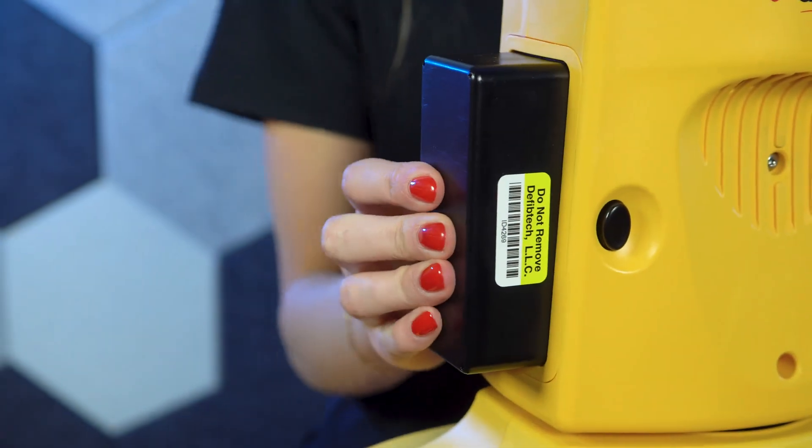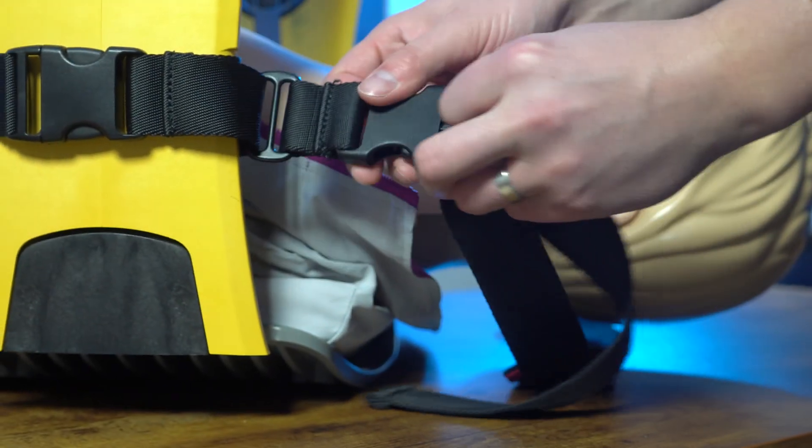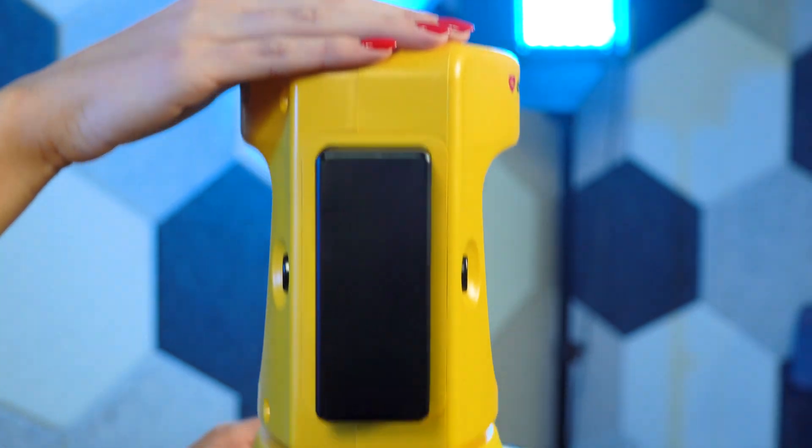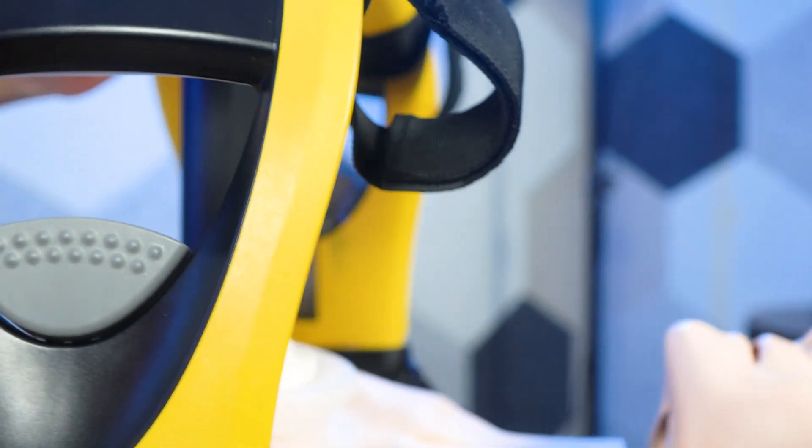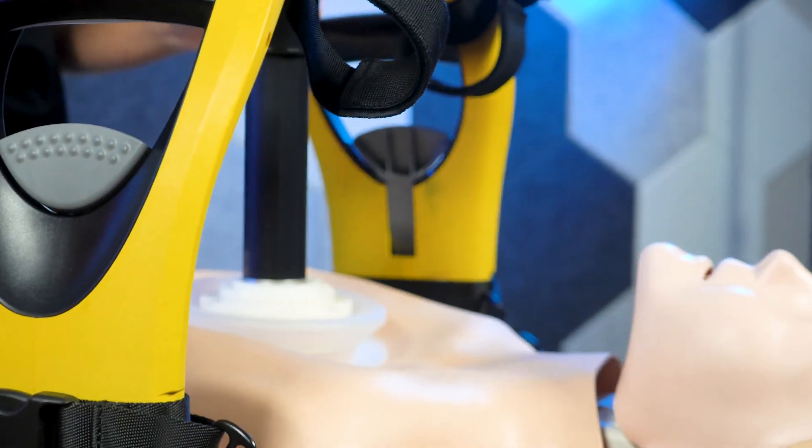The ArmXR is an affordable option saving your first responders time and allowing your team to do more with less. Eliminate errors that can come along with manual compression, save time, and reduce stress and fatigue with the DefibTech ArmXR.